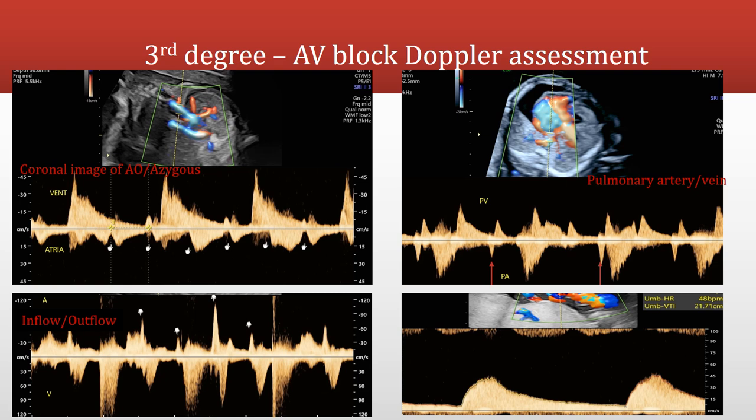Looking at Doppler assessment of third degree AV block: on the aorta and azygous vein parallel artery and vein image, the atrial contractions are indicated, and the ventricular contractions are also clearly visible. The same can be seen on the inflow-outflow image. On the pulmonary artery and vein image, two AV intervals are measured and found to be significantly different from each other, confirming complete dissociation between atria and ventricles.